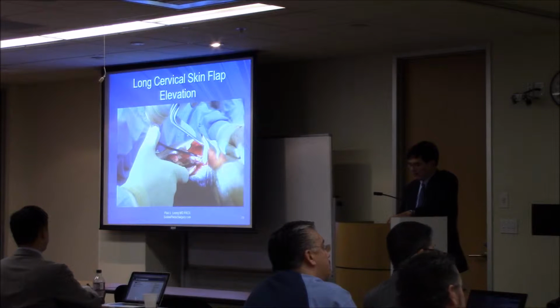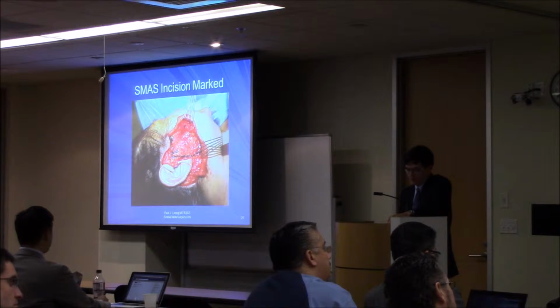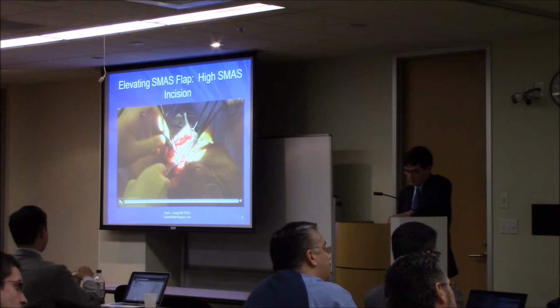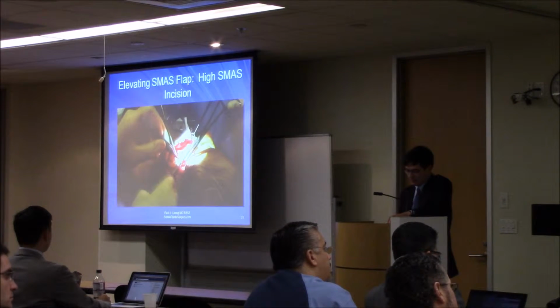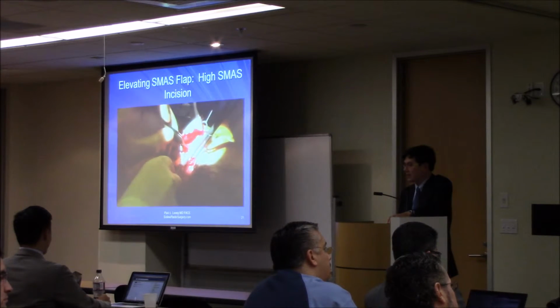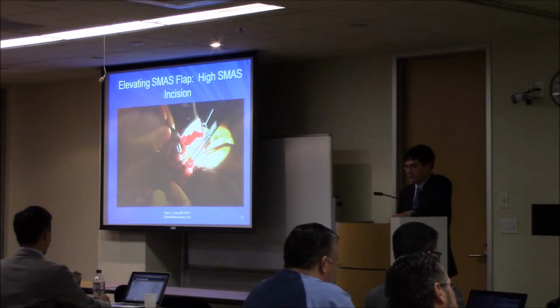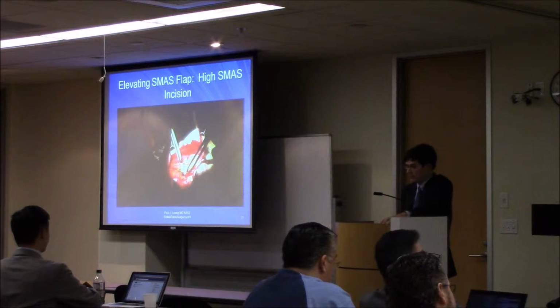Then I lift a long cervical skin flap. Here's fundamentally where the high SMAS incision is. It's pretty geometric. Right here, we're right above the level of the zygomatic arch, and we come back fairly posteriorly. This is me making that incision where you might be concerned about the frontal branch. We just make sure the tissue is tented up. I don't think you're ever going to get the temporal branch going over the zygomatic arch if you simply tent the tissue up, and there are 15 different ways to do that. You can see I've got these Allis clamps pulling it up. I'm not even sure that's necessary.